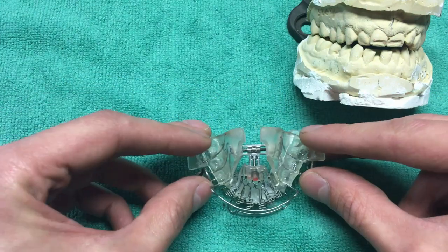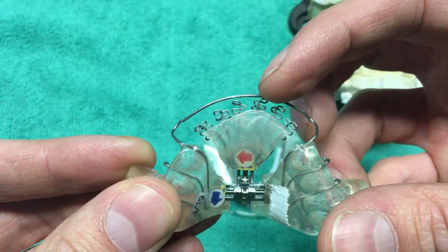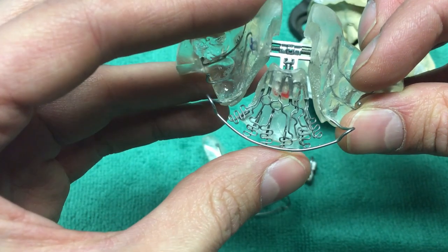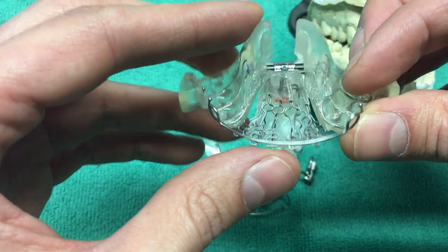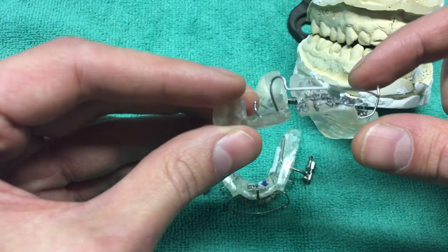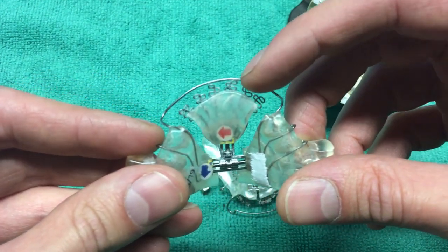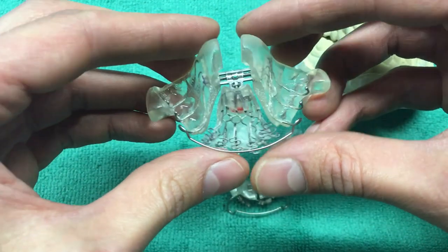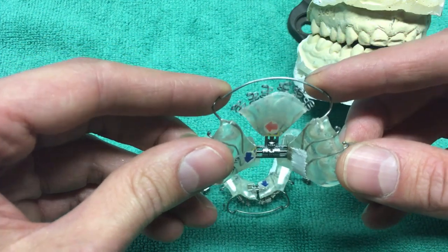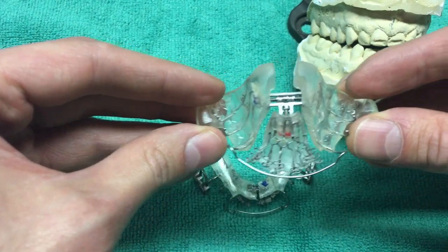The basic general gist of how these things are supposed to work has two components. The first — which is the goofy part — are these springs here. These are super light, very thin gauge stainless steel, and they press up against the back of my teeth and touch the palette a little bit. The way these things vibrate and the light pressure they apply — mainly the vibration — stimulates or induces bone growth in your upper and lower skull and jaw.